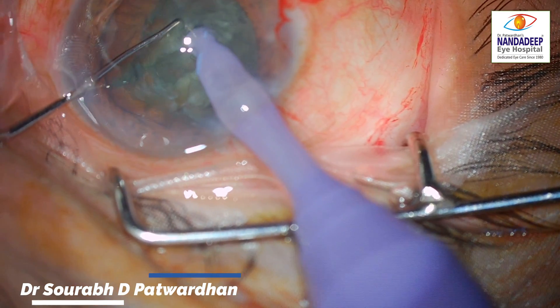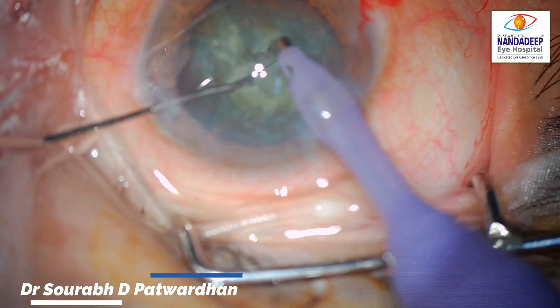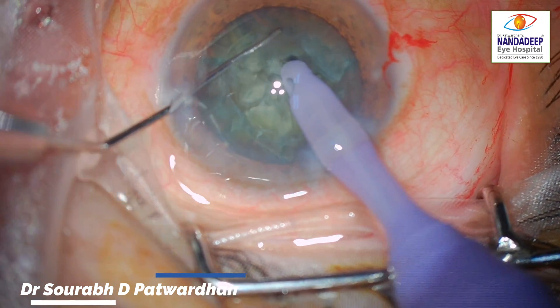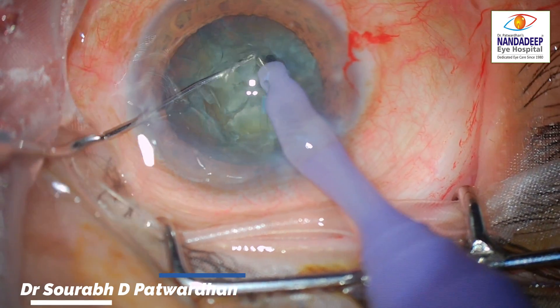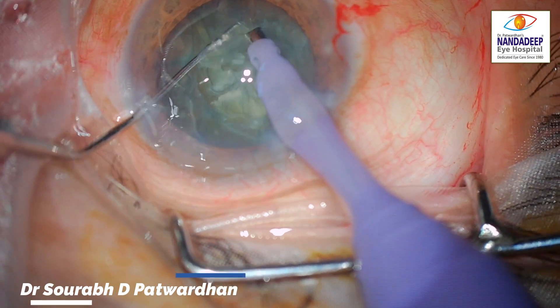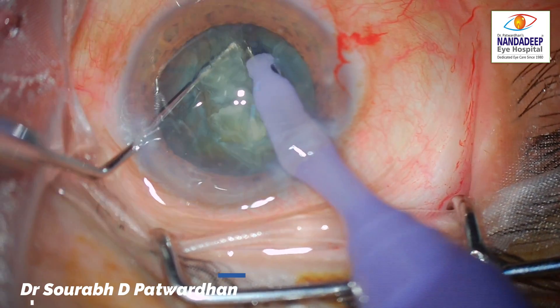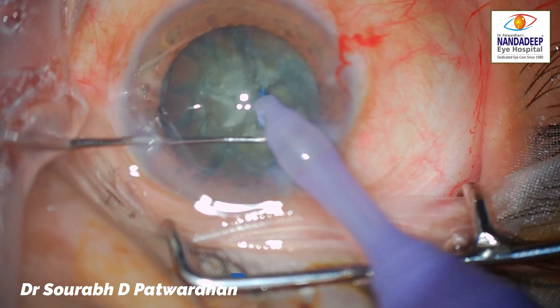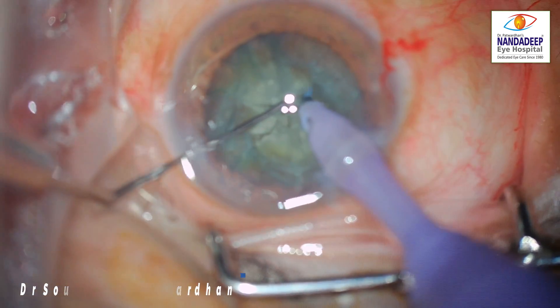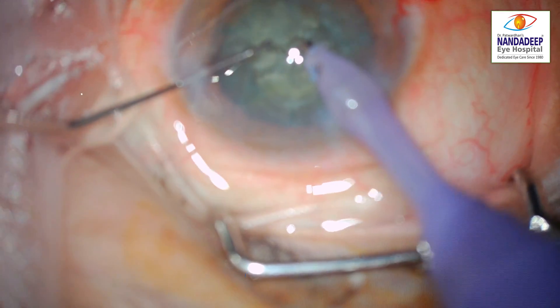He is trying to chop another piece — this is a better effort because he did not try to push the nucleus away. Now look at this attempt — much better. He has buried the tip, slightly pulled the nucleus towards the tip, and then divided. But again, not a complete division, as you can see — the crack has not gone to the posterior plate. So at the center, all the nuclear pieces, though divided, are not divided completely. They are all stuck. This is where it all starts — the stuck nucleus.